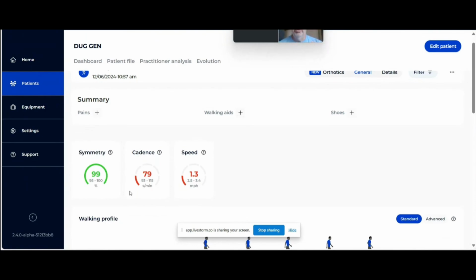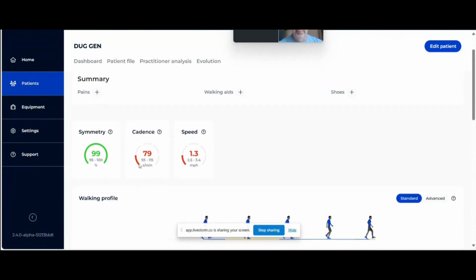diabetic, and at this moment in time, just not very well managed. He's a type 2 and a type 1 diabetic, and difficulty taking on body mass, and managing his insulin has been very, very challenging. He has some other things going on too that I'm not going to tell you just yet, but just to again highlight, we see that cadence is really low and the speed is really low.